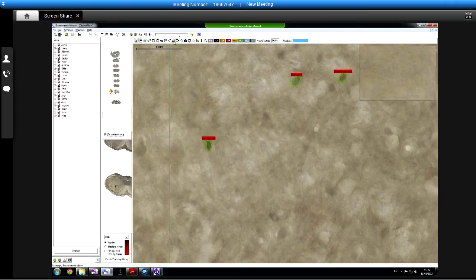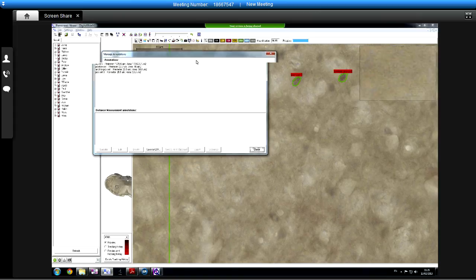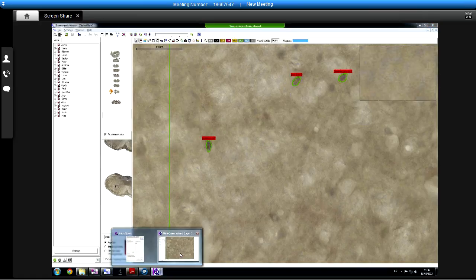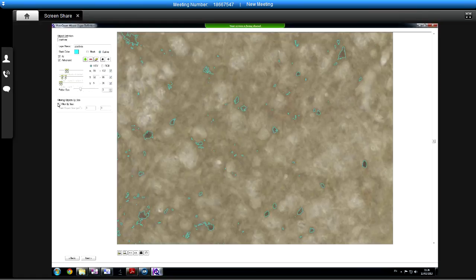Okay. And we can see that the areas, this one's 51 micron square, this one's 59, this is 46. So it looks like a true positive, a typical area range between 35 micron squared and 70 or something like that might be a good boundary there. So I just go back to histoquant here. What you'll see here is I can filter by size, and I can say valid object size is between 35 micron squared and 70, and then I'm just hitting tab or enter after I put in each number.